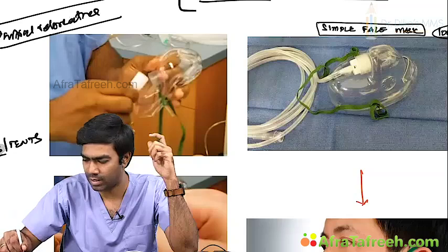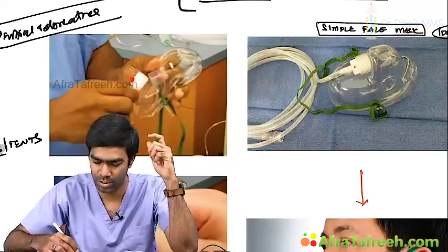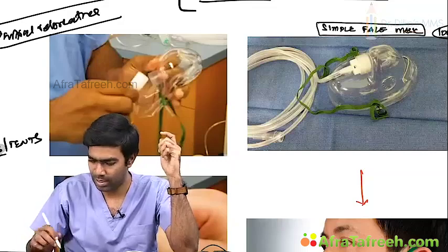So you can see in this example how the staff nurse has done this. First they are pulling out this oxygen connecting area in the simple face mask. You just pull it out. That's what she is doing here. She just pulls it out, and after pulling it out, this is the reservoir here.